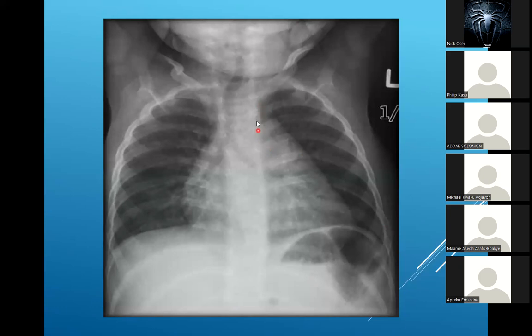So I think it's being pushed. Usually, you need a history and examination to ascertain for a fact, because this one is not so clear what it might be. That's why I made it broad. Now, what are some of the things that could cause a push or pull? Just give us some. When pressure builds up in the chest cavity. Oh, but we've just gone through that. That's why I want you to mention them.